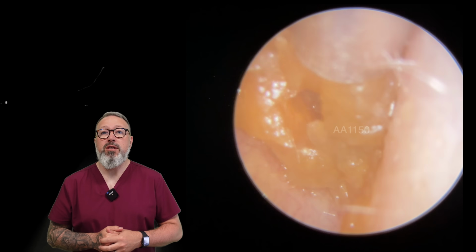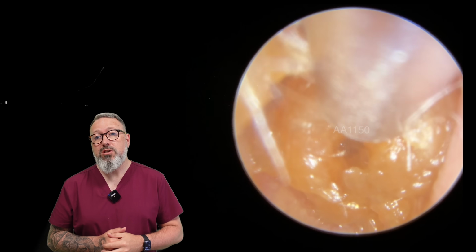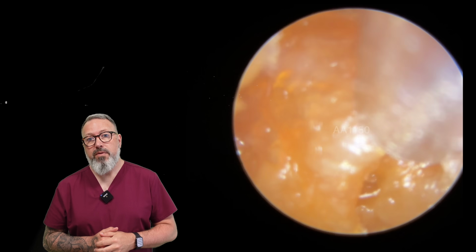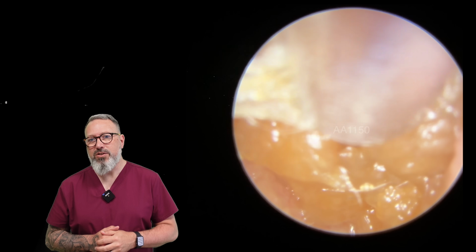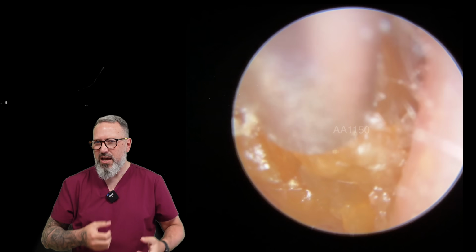So you can see for this first one here, we've got this very, very thick plug of wax, and this is actually a mixture of wax and skin. So we're just going to start to pull this down the canal here. It's holding on quite tightly. So we've got this kind of soft, squishy wax surrounded by this thicker skin layer here.